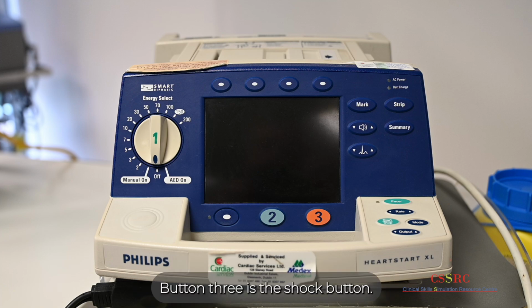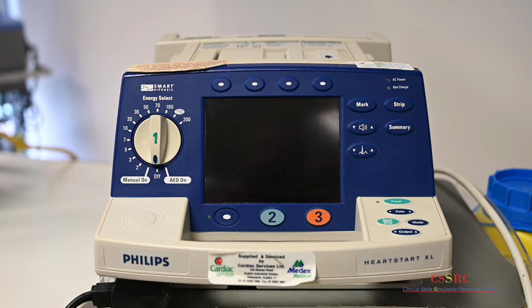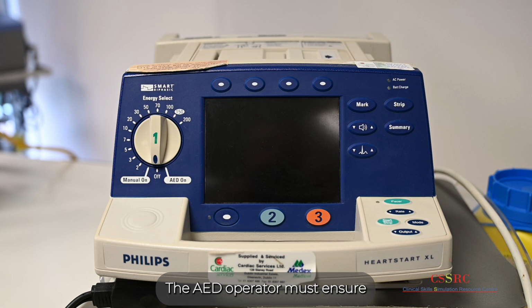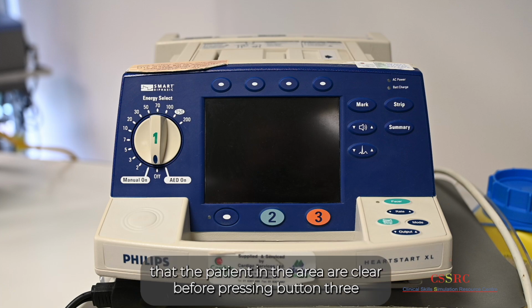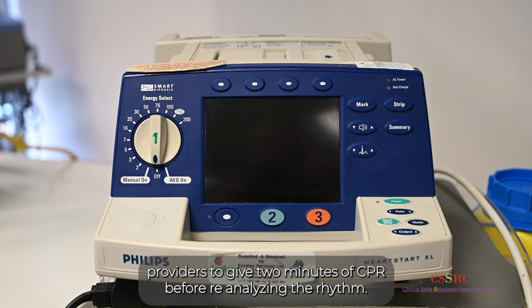Button 3 is the shock button. If a shock is required, the AED will take a few seconds to charge. The AED operator must ensure that the patient and the area are clear before pressing button 3. After a shock, the AHA BLS algorithm requires providers to give 2 minutes of CPR before reanalysing the rhythm.